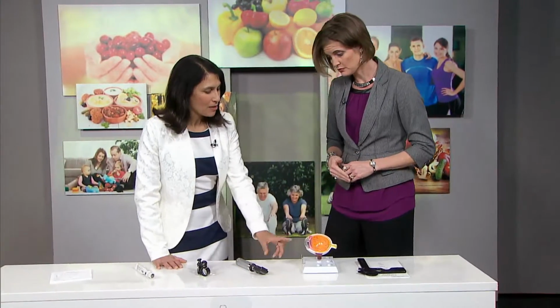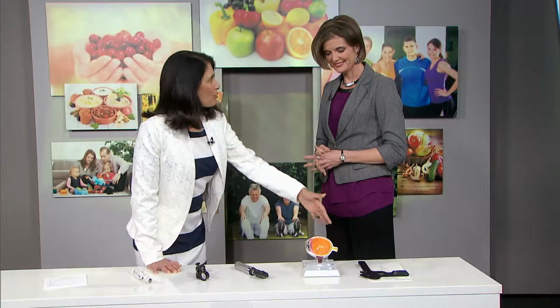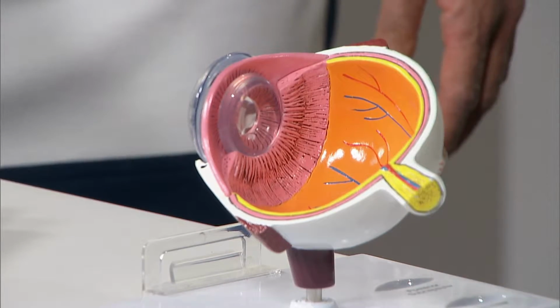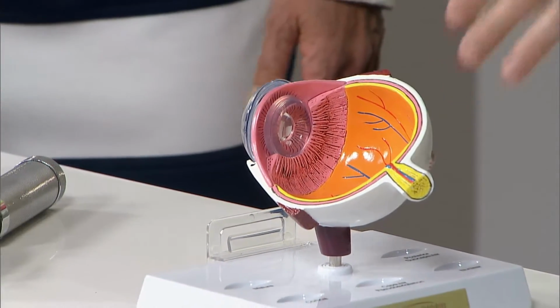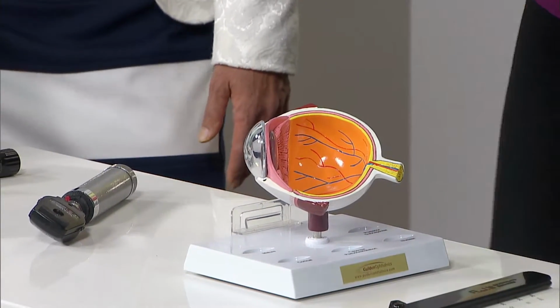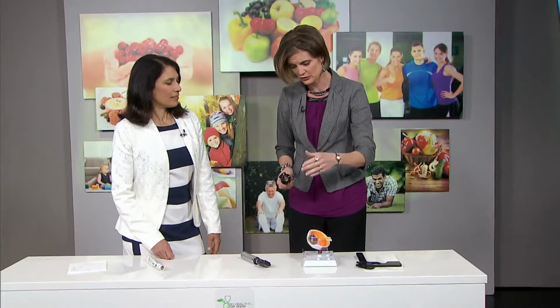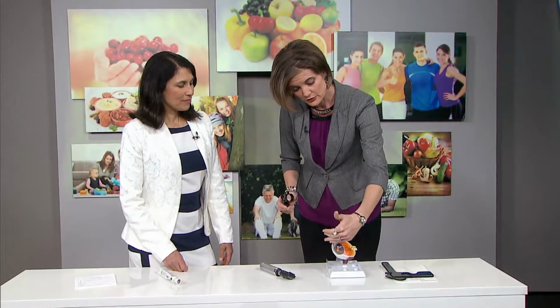Now, tell me, how do you check? I mean, we're looking at this eye, we know it's all enclosed. How do you see all these blood vessels in the retina at the back? Well, the first time that I saw them, I was really amazed that the pupil is really a window into the inside of the eye. So when it's dilated, and that's how I do a full eye exam, I'm able to, with the right magnification equipment, that slit lamp I was telling you about, and some handheld magnifiers, view the inside of the eye through the dilated pupil.